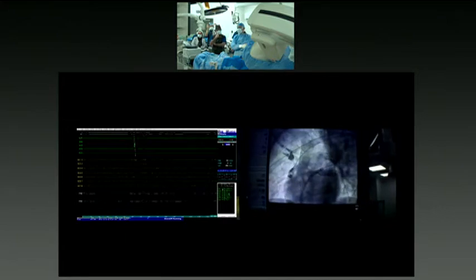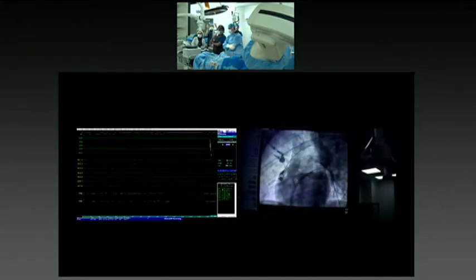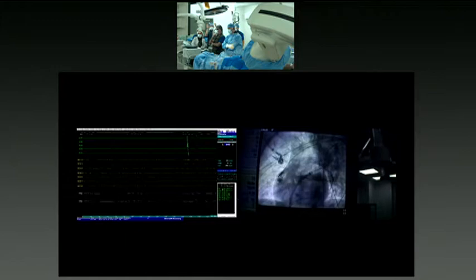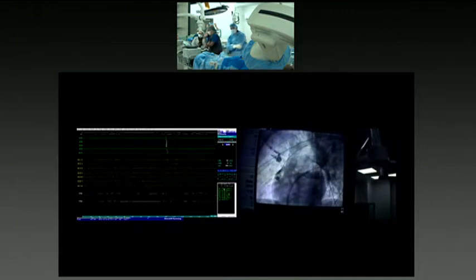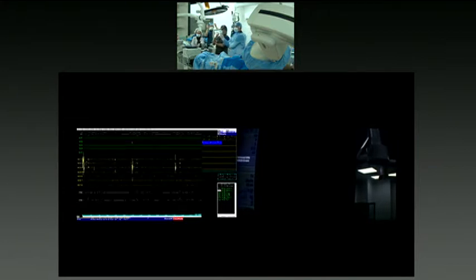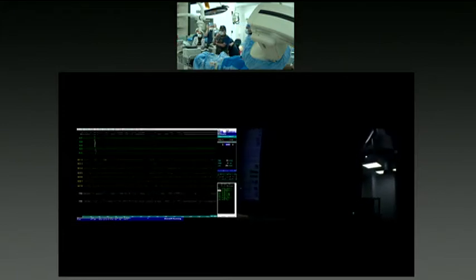This is wonderful. Once you finish the other veins, could you also save some good sequences when you're working in the right upper pulmonary vein, so that when we come back after the break, we can talk about protection of the phrenic nerve, which is an important concept that the audience and all of us would be interested in. Yes, absolutely. The next vein that we will treat is the right superior vein, so we will use all the techniques to avoid phrenic injury.